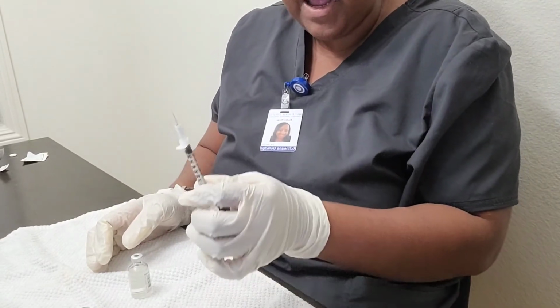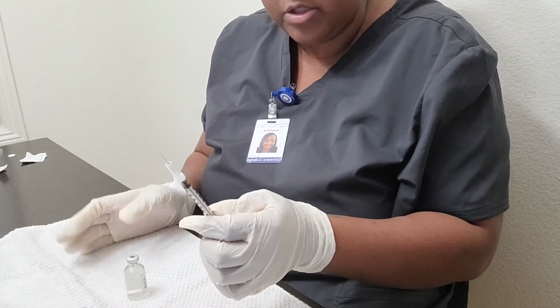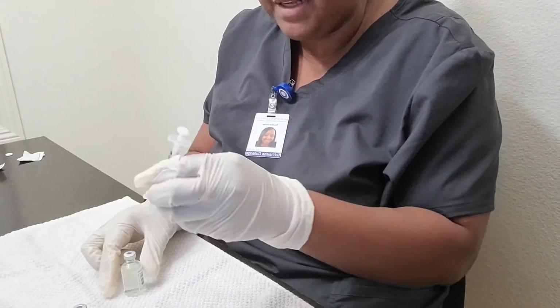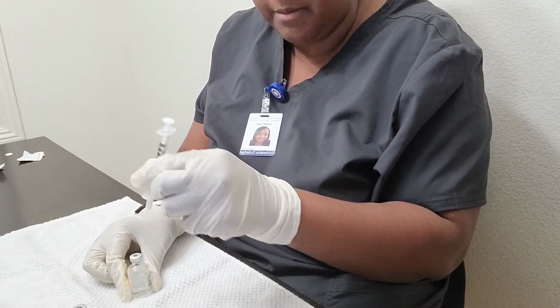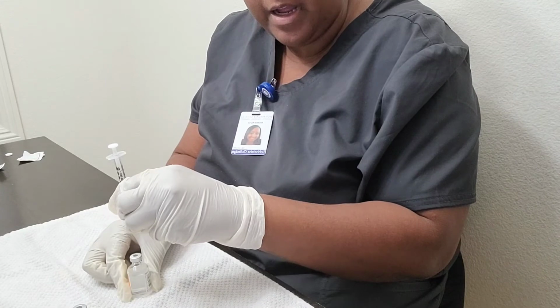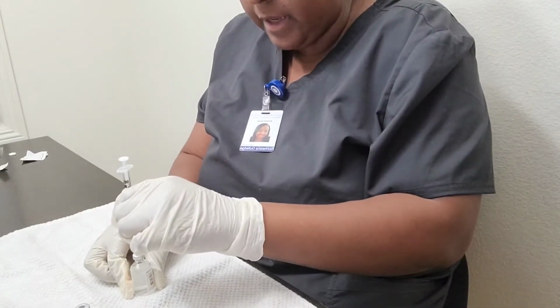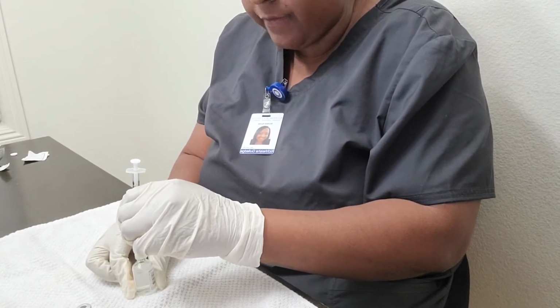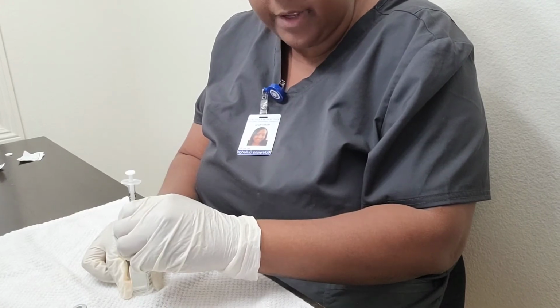Okay, so now I have my 4 units of air, and I'm going to hold the syringe with my dominant hand, and hold the insulin with my non-dominant hand. Then I will insert the 4 units of air into the vial, quick and fast.